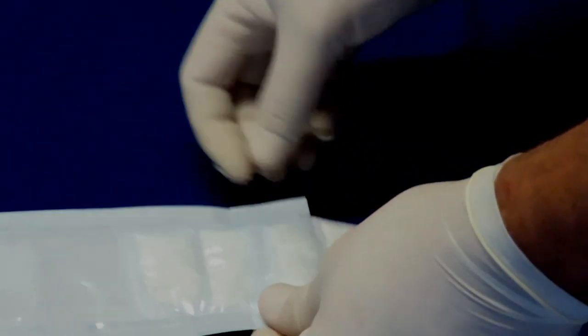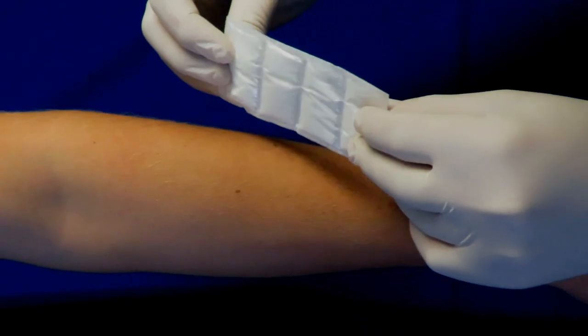Remove the Serdac Basic from the sterilization pouch. Place the shiny side on the wound, making sure the dressing covers the entire wound.